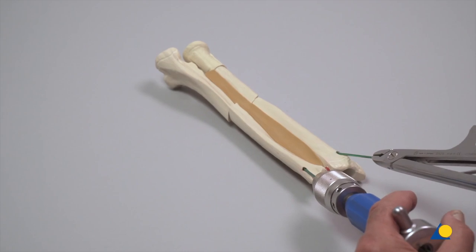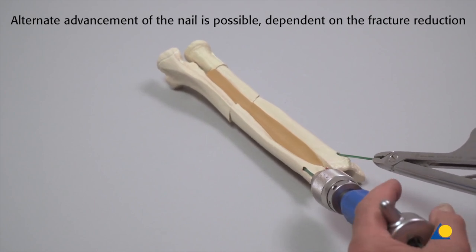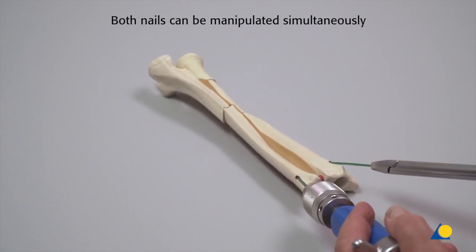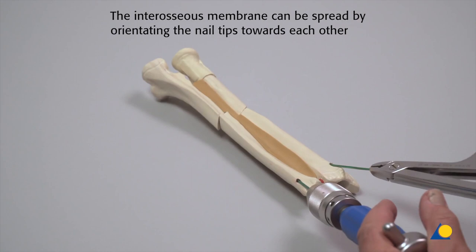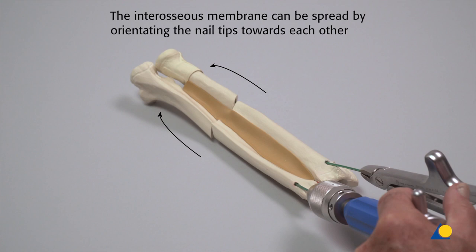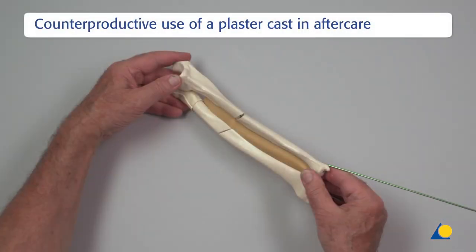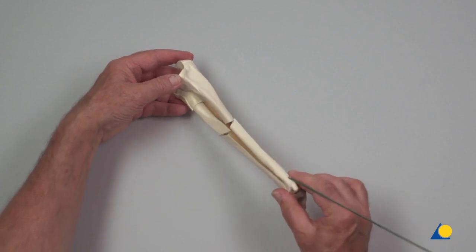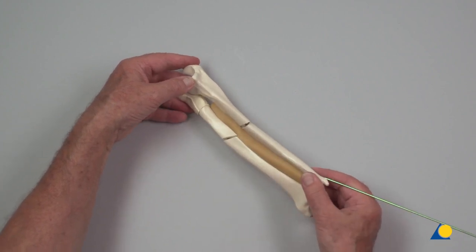The advantages of the retrograde insertion technique for the ulna include: alternate nail advancement dependent on fracture reduction; by using extraction pliers and the inserter, both nails can be manipulated simultaneously; and the interosseous membrane can be spread by orientating the nail tips towards each other, which is important for stable fixation and full forearm function in pronation and supination. The use of the Essin method maintains normal pronation and supination after healing. A plaster cast is not indicated and is counterproductive as it can block pronation and supination in an undesired position.